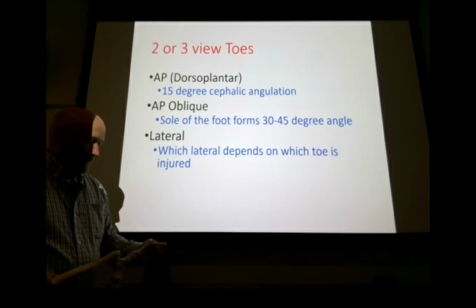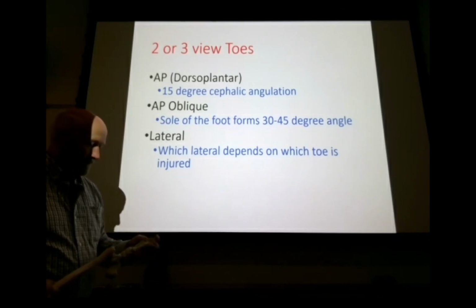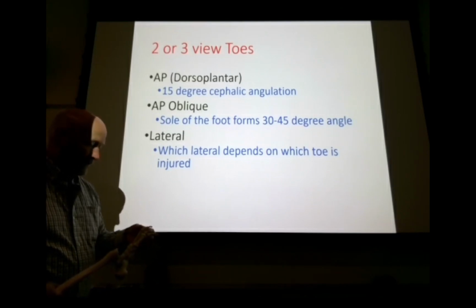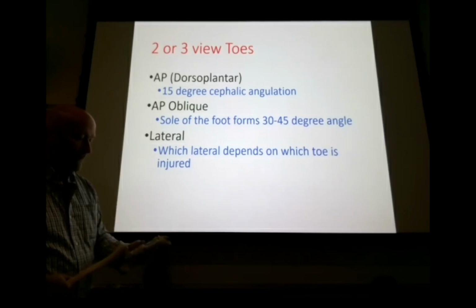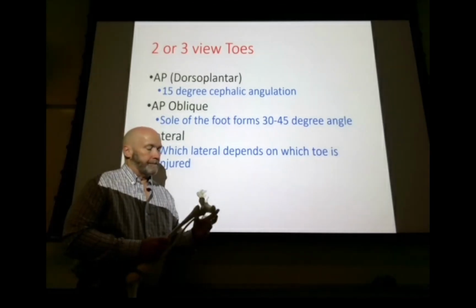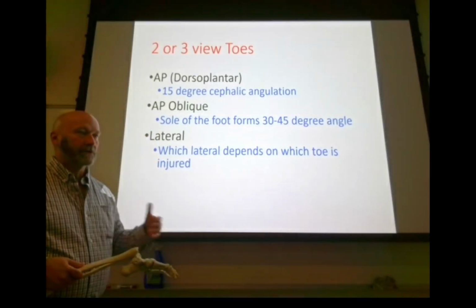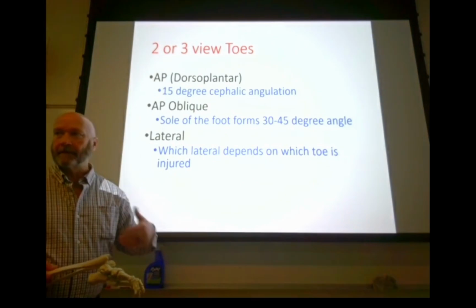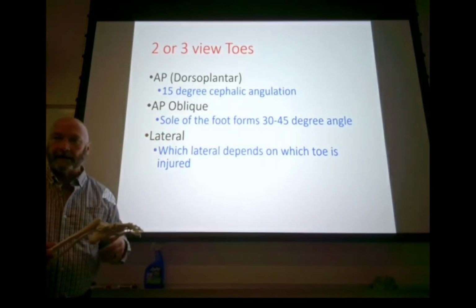But what the medial lateral projection gives you that the lateral medial projection does not is a couple of things. So the answer to that question, if you run into the question, which lateral consistently provides better lateral projection, is with medial side down.